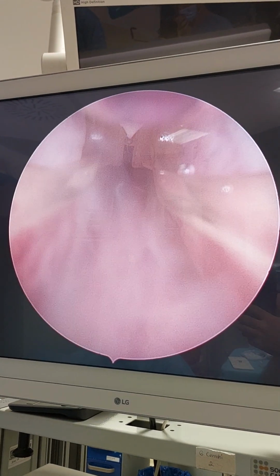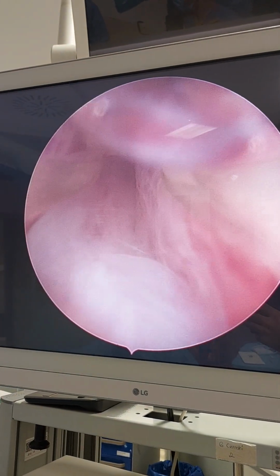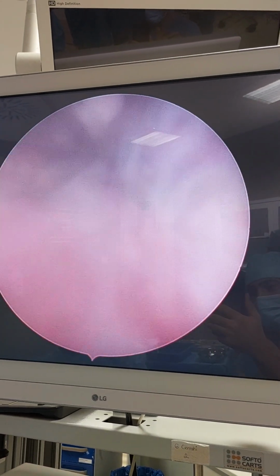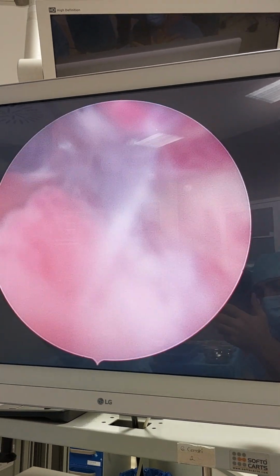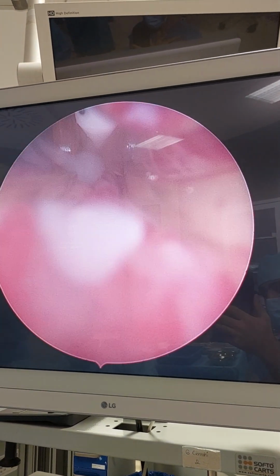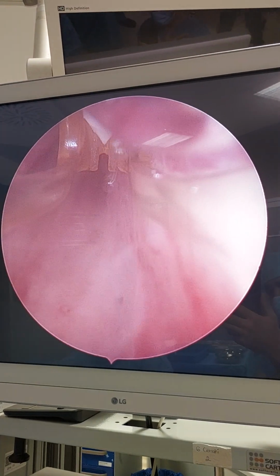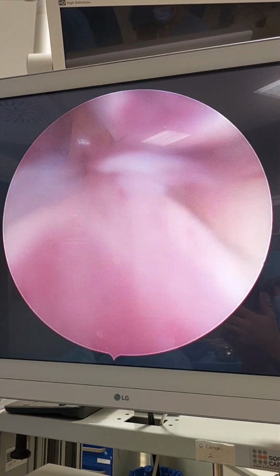Okay, see this inflammation. I am washing it and it's coming again. Washing. And when I squeeze the prostate, the inflammation is coming. Washing it, squeezing. See this. Yeah, I am pressing the prostate. Look at this. So I think it is a good idea to clean this infection, to drain this fluid first, because the hot steam will be absorbed and cooled down with this inflammatory fluid, which I don't want, because it will decrease the effect of the steam.